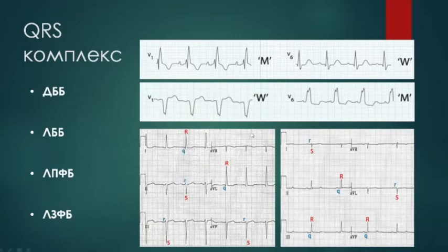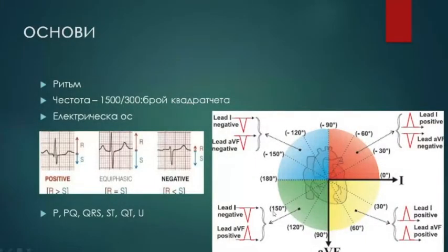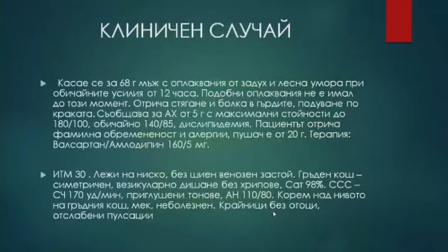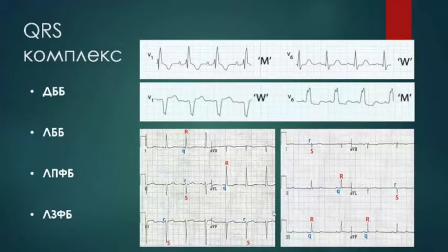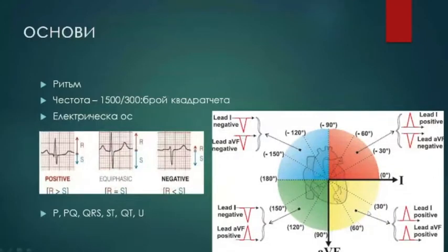The criteria are mainly abnormal axis deviation, as you can see. Can somebody define this axis? Here. The first, this one. It's easy. Okay, so lead 1 is positive, yes. aVF is negative. Yes. That means it should be between 0 and minus 90, right? Yes. You are completely right. I should put an axis here as well. So lead 2 is completely negative, so it's above minus 30.